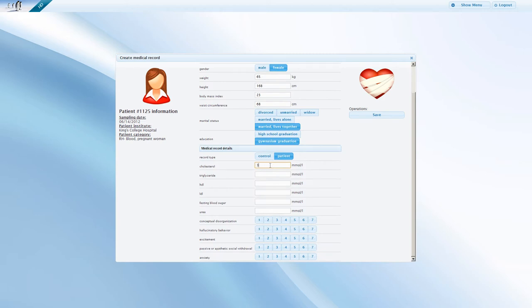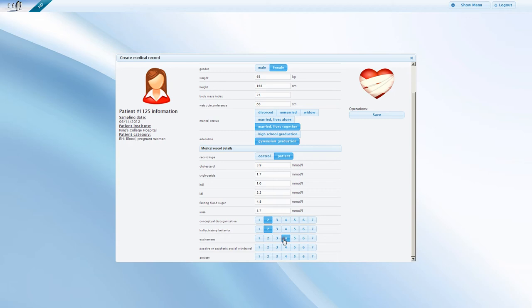In this example, we follow with entering relevant medical information. The number and content of the different forms that are related to a particular patient are completely customizable and can be easily adjusted to your own project. By clicking on Save, you have completed the creation of a medical record module.